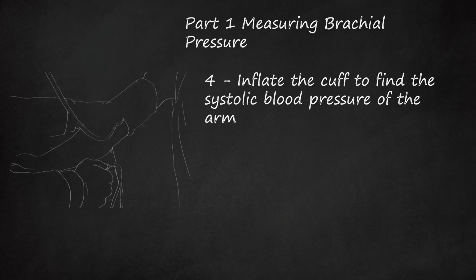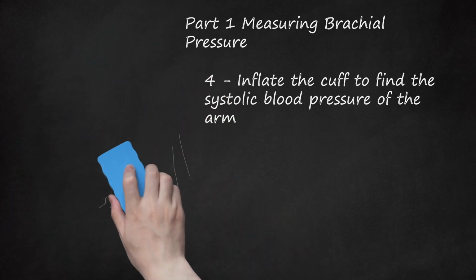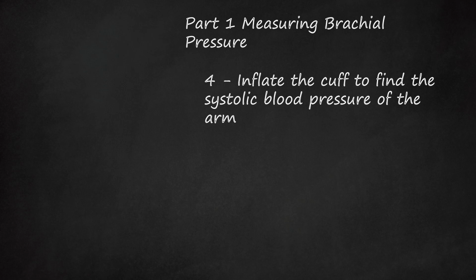4. Inflate the cuff to find the systolic blood pressure of the arm. To take the blood pressure reading, place the diaphragm, the circular piece, of the stethoscope on the brachial pulse. Close the valve of the hand pump and use it to inflate the cuff to about 20 mm of mercury above regular blood pressure or until the pulsating sound or your patient's pulse is no longer audible. Systolic pressure describes the maximum arterial pressure created by the contraction of the heart's left ventricle. Diastolic pressure describes the minimum amount of pressure created when the ventricles fill with blood during the beginning of the cardiac cycle.